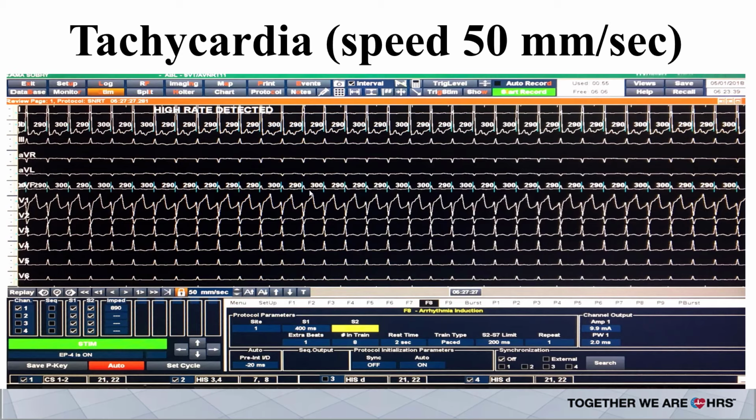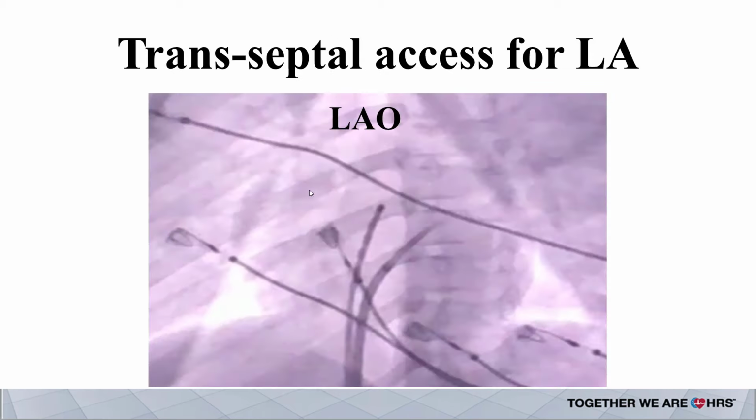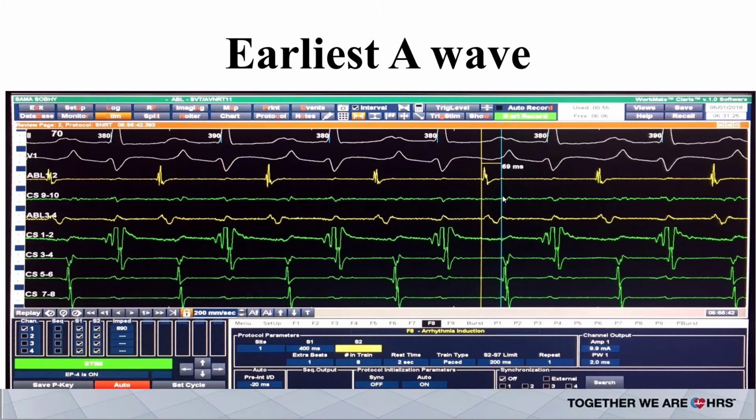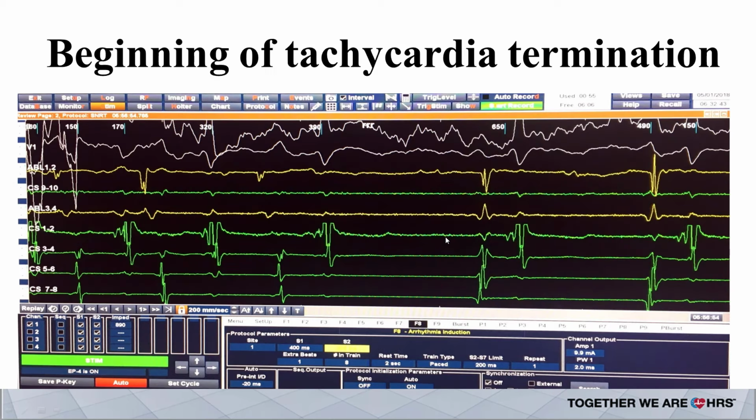This is in the EP lab using the St. Jude machine and 12-lead ECG, and then we did transseptal puncture, and we went to the left atrium, and we started mapping in the left-sided pulmonary veins, and then we went into the left atrium itself, and we got a very good signal, 69 milliseconds before the P wave. This is the decapolar catheter inserted in order to see some other signals at the site. And we delivered the RF current at this site, and we terminated the tachycardia successfully.